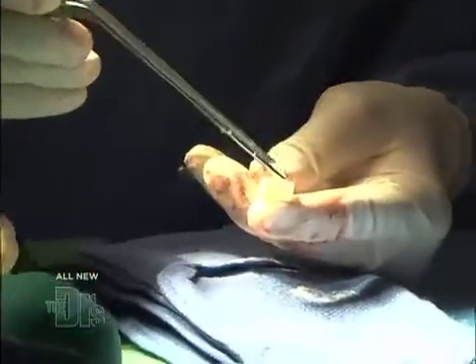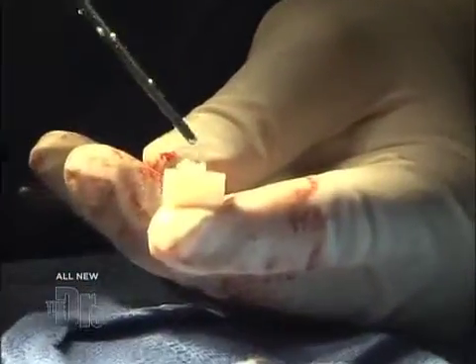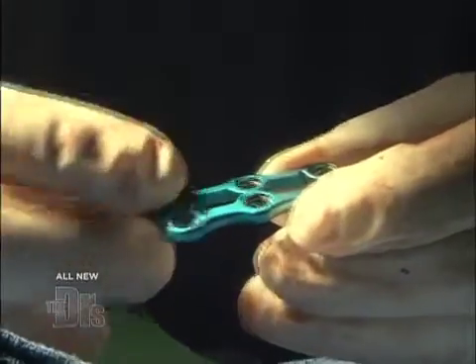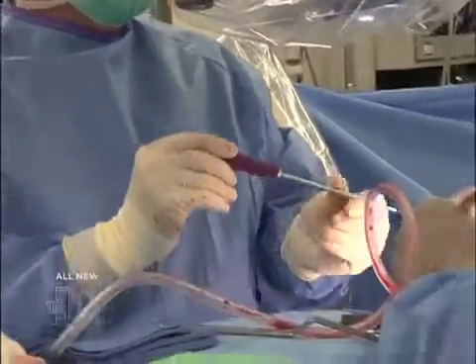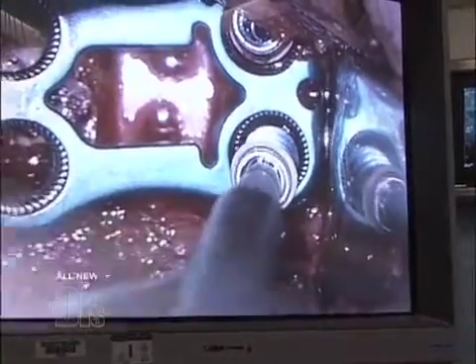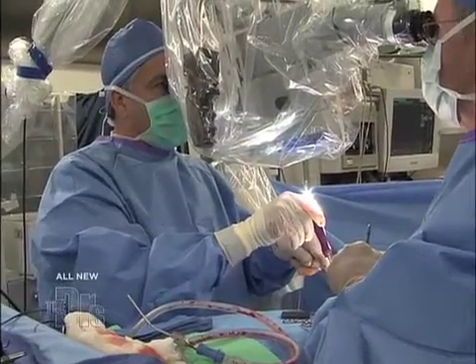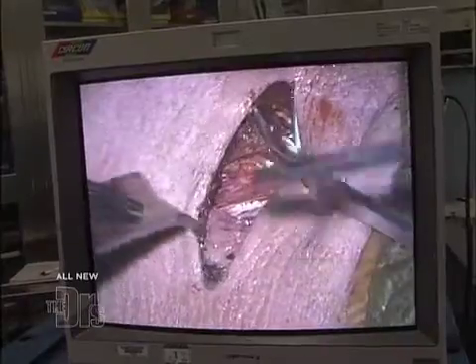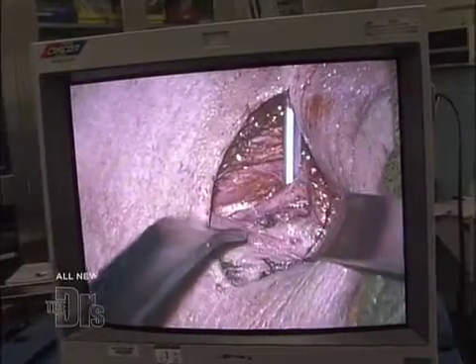This is the implant — it's a cadaver bone mixed with OsteoCell Plus, the Nuvasiv product that allows for bone growth and bone fusion. This is the Nuvasiv anterior titanium plate system. As you can see, it has the screw holes. The screws automatically lock to the plate as you screw it in. By using the plate, you will not have to use a collar after surgery. The retractor comes out and the tissue really falls back together nicely through this relatively small incision.